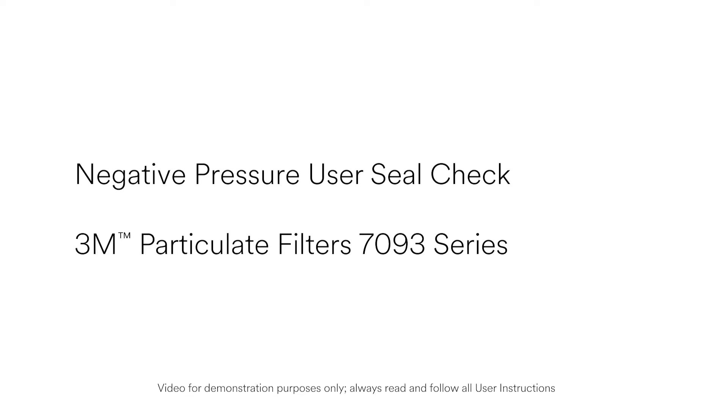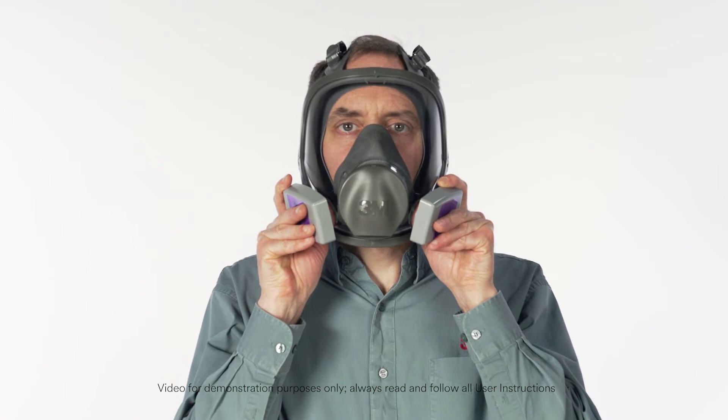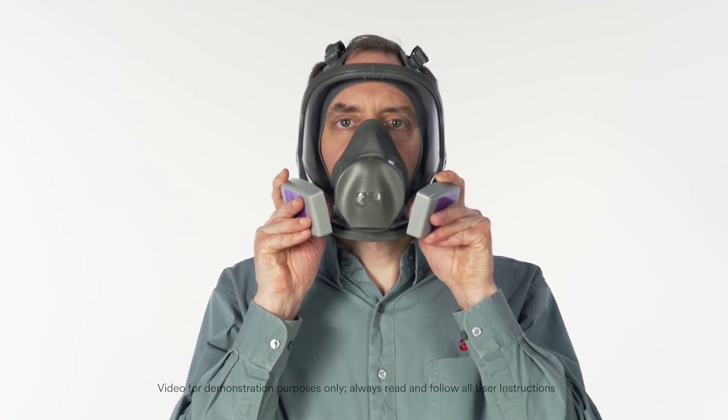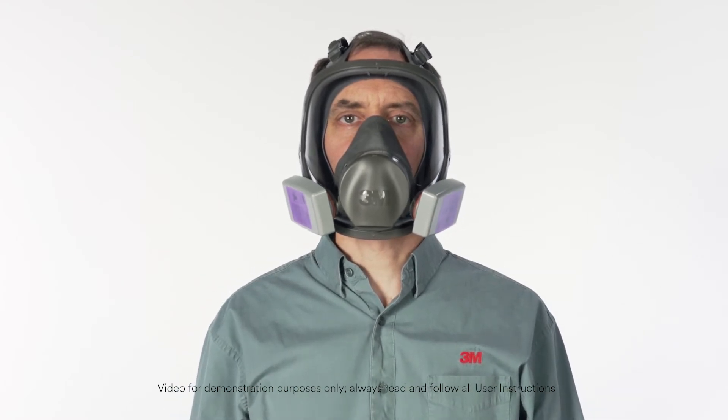To perform a negative pressure user seal check with the 3M Particulate Filters 7093 Series, squeeze to compress the filter. After you've sealed the filter inlet, inhale gently. If the facepiece collapses slightly and you feel no air leaking between your face and the face seal, your respirator has sealed properly to your face.